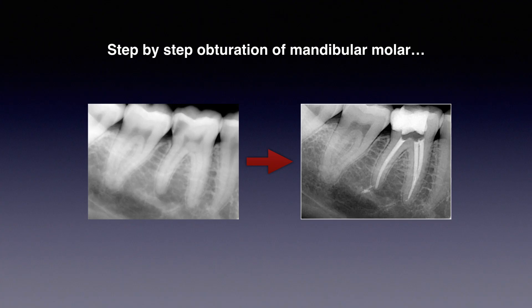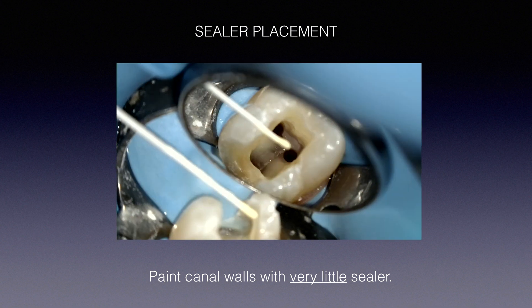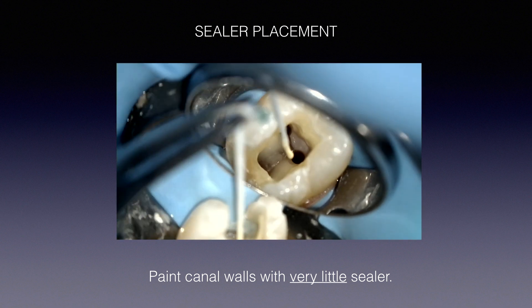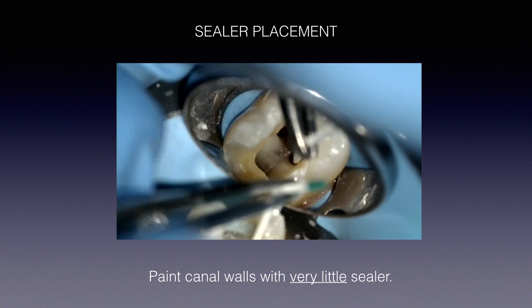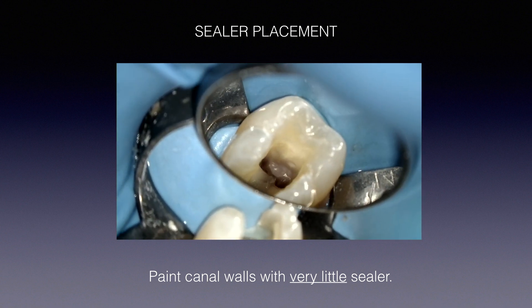Let me show you a step-by-step of a clinical case — a lower molar, before and after. Let's start with sealer placement. The canals are fully instrumented, irrigated, and dried — you're ready to obturate. First, paint the canals with just a little bit of sealer. Remember: less sealer than what you think.